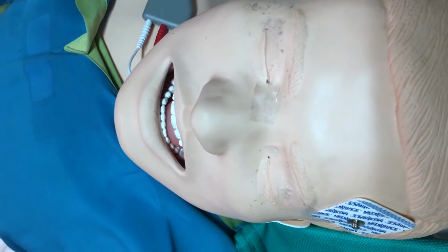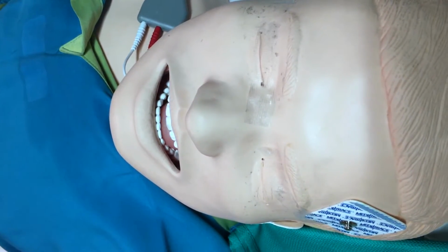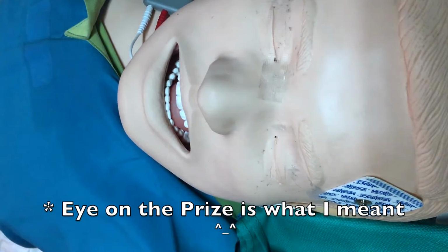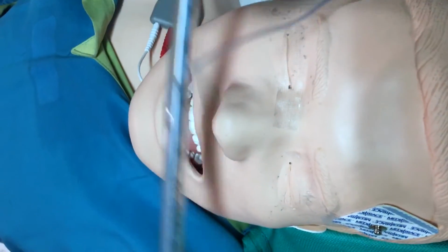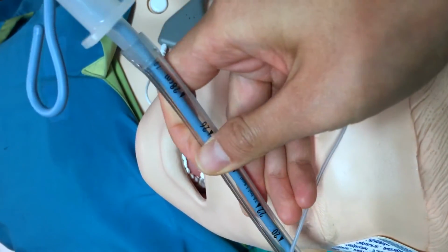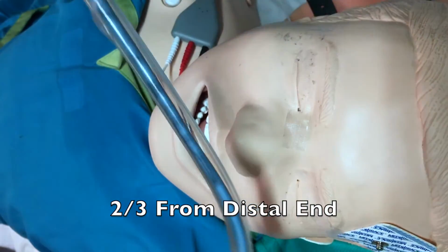Once you have an adequate view of the vocal cords, you want to ask your assistant to hand you the ET tube and keep your eye on the prize, because you never know when the view of the vocal cords can be obstructed later. When handed the ET tube, you want to hold it like a pencil like this, about 2/3 distal to the end.